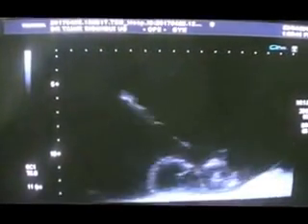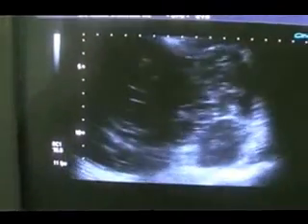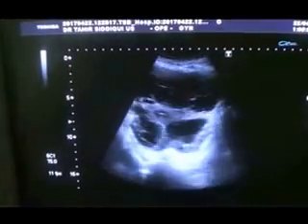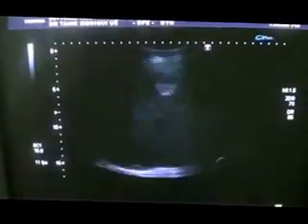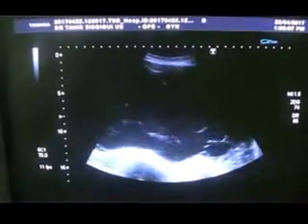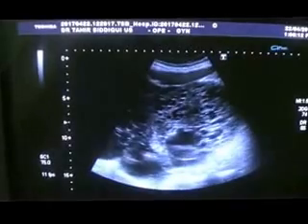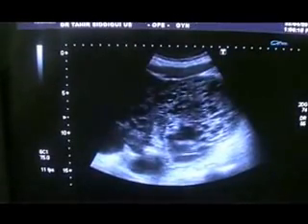Now I am in the right side of the abdomen. You will see fluid with echoes. You see, fluid with echoes. Now on the left side, so it is expanding on both sides of the midline, extending from the pelvic cavity, this is the pelvic region, up to the epigastric region, and then expanding on both sides of the midline with septa, with debris, no blood flow within this debris, within this multi-septated area.